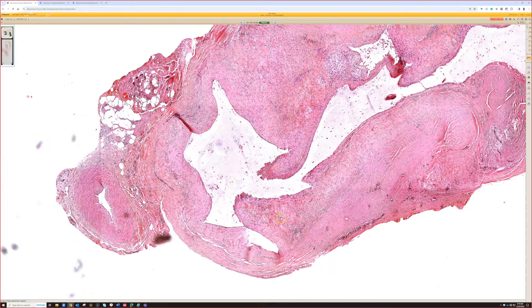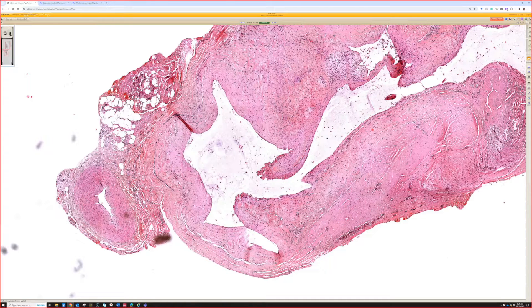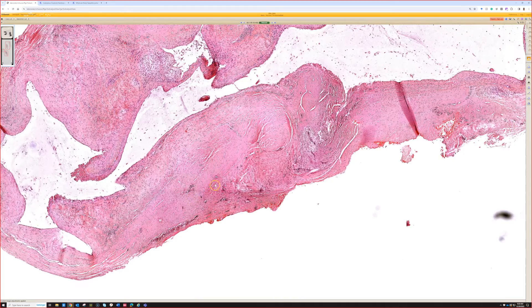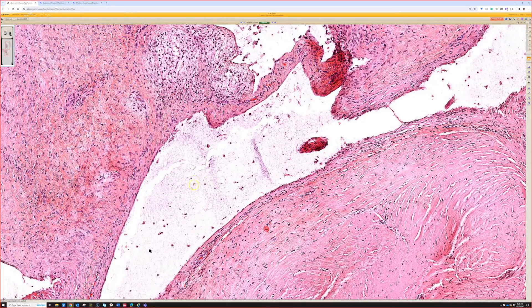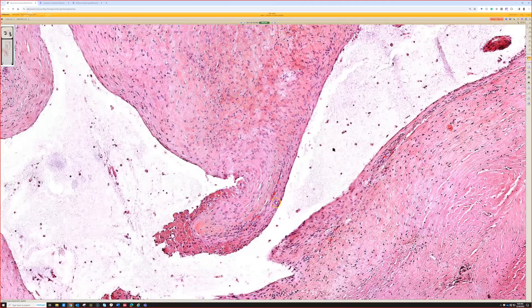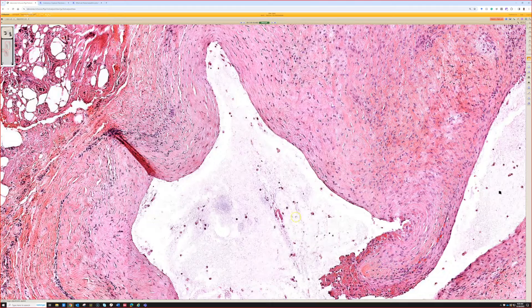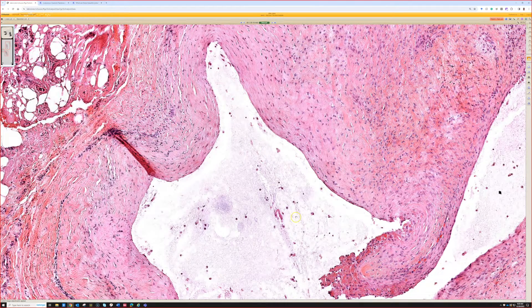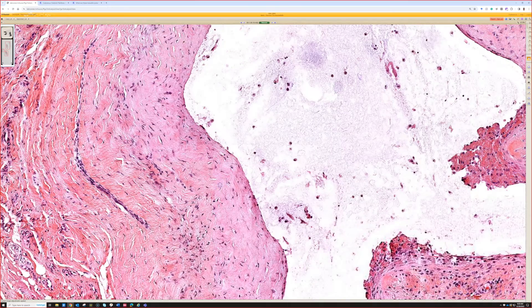The ganglion cyst, synovial cyst, Baker cyst (a large ganglion cyst from behind the knee), retinacular cyst on the finger, and a few other orthopedic-related names are all to me the same spectrum of process. They have a dense fibrotic cyst wall and blue mucin/myxoid material - which is actually just synovial fluid but looks just like mucin - plus or minus a lining of synovium. Most ganglion cysts I see have very little, if any, actual synoviocytes; they just have dense, compressed, sclerotic collagen.